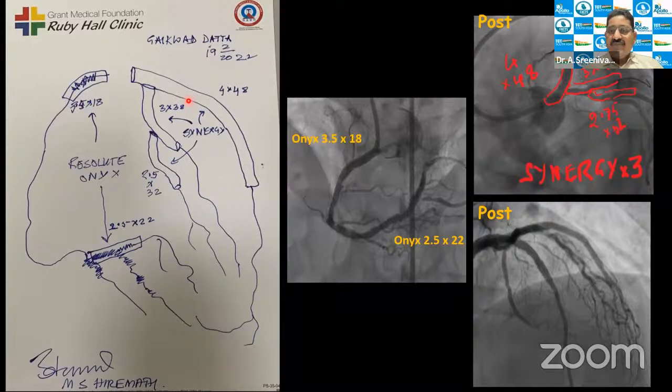I think you went to the left. And the other credit to the latest generation stents is that, in spite of the 2 layers of 2 mini crushes, the stent still goes distally. And you can plan the stent and place the stent into the distal OM when there is a point of bifurcation. That's a great tribute to the later generation stents. They go in spite of stents being done. But always, as you showed, distally we tend to tackle first.